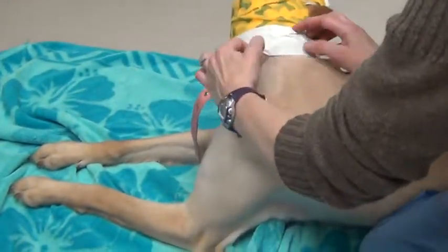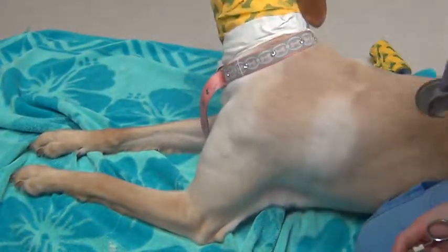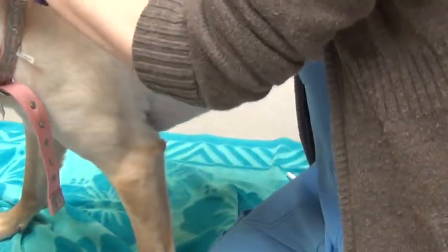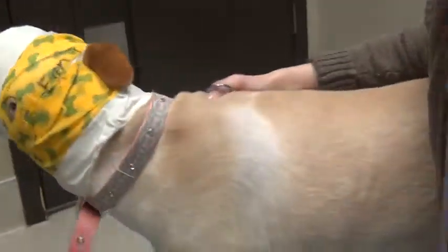So we're going to go ahead and remove our hematoma bandage now. Alright, Miss Stacy. Stay. Okay. With this one, the best thing to do is to actually remove it from the top. You're going to have to come as close as you can to the other ear.